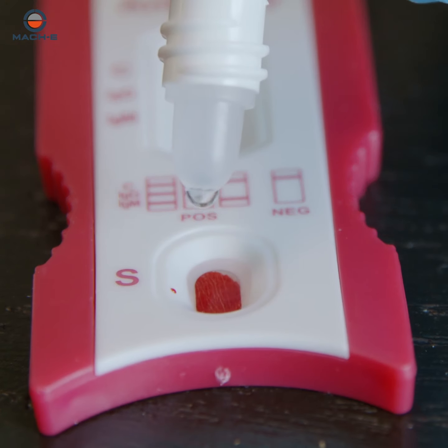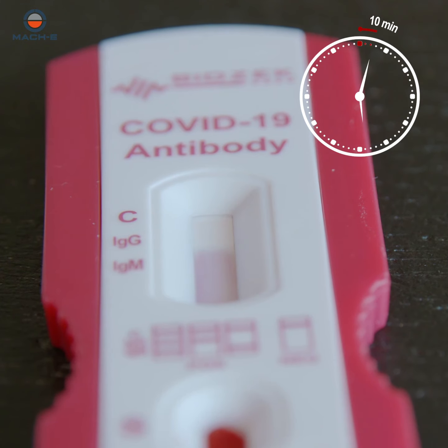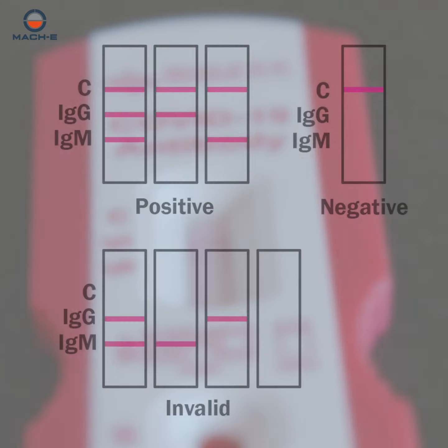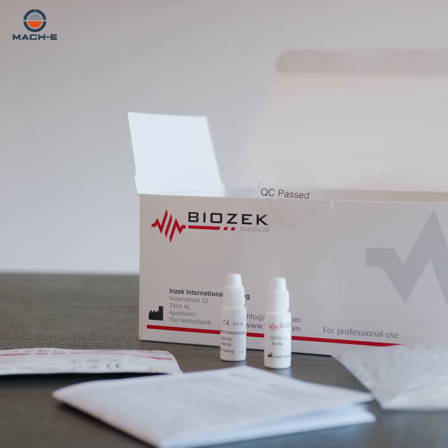Then, add two drops of buffer to the specimen window and start your timer. Last, read the results ten minutes later. A reliable test with unsurpassed sensitivity and specificity. The only European test in the market.